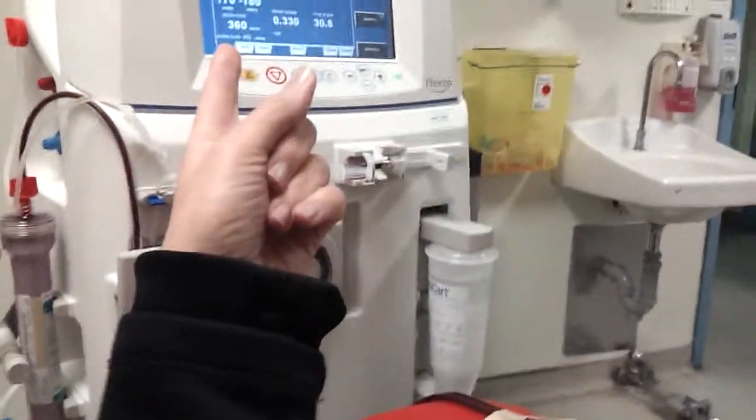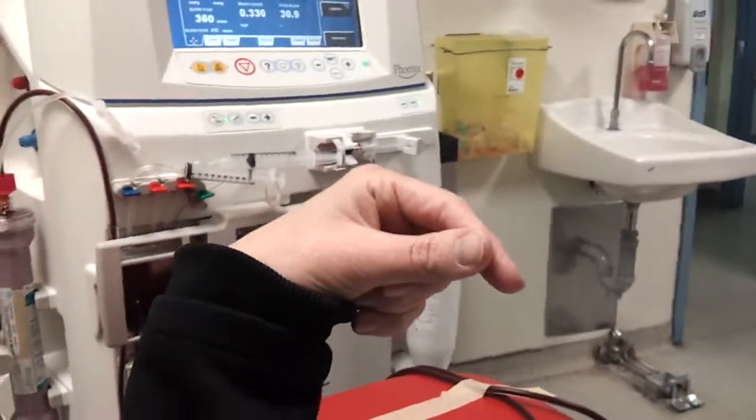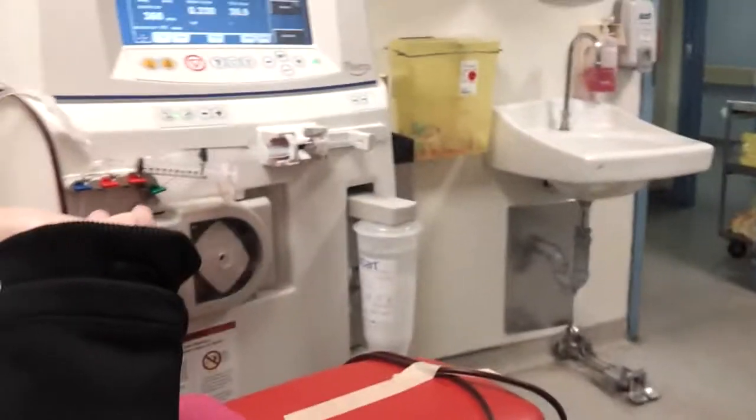So the faster that I pump here, or my legs, to the machine, like I said, your blood's going to get pumped faster because you're pumping your own blood that much faster. Therefore, more blood's being cleaned. Now, it doesn't show on here how much blood's being cleaned by me being on the bike, but when my blood clearances come back from the blood work they do each week, it will actually show on there that I'll have better clearances.